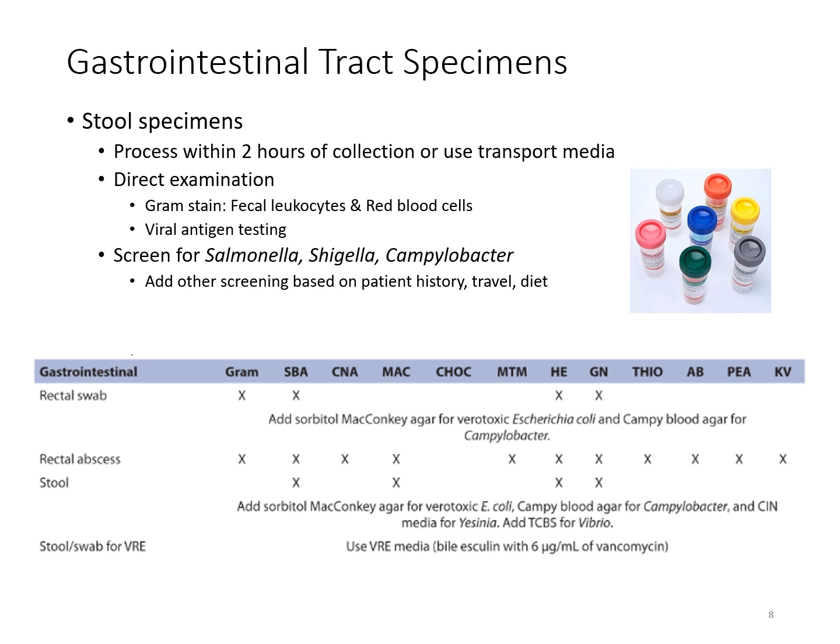If they're just doing a stool culture, it might just be blood agar, MacConkey, and HE, and then some other gram-negative type of agar to set that culture up on. The sites may choose to add things like sorbitol MacConkey to look for certain organisms, or even some of the other rare media to detect things like Vibrio, or just to differentiate the Salmonella, Shigella, and things like that.